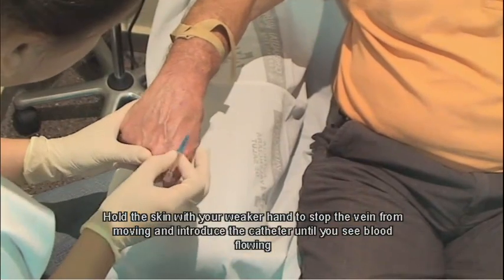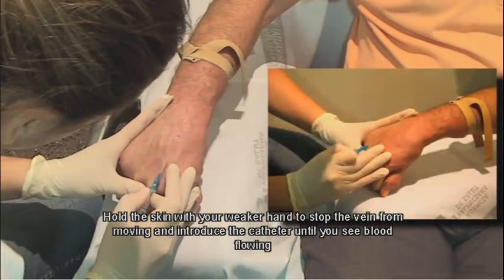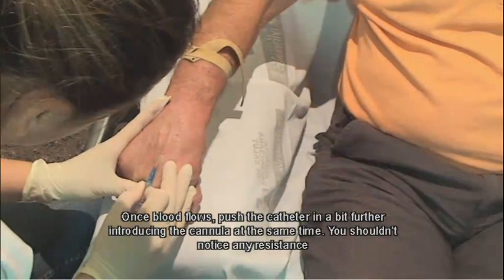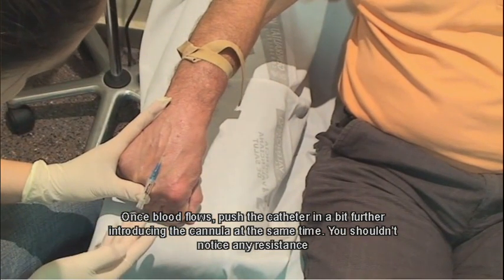Hold the skin with your weaker hand to stop the vein from moving and introduce the catheter until you see blood flowing. Once blood flows, push the catheter in a bit further, introducing the cannula at the same time. You shouldn't notice any resistance.